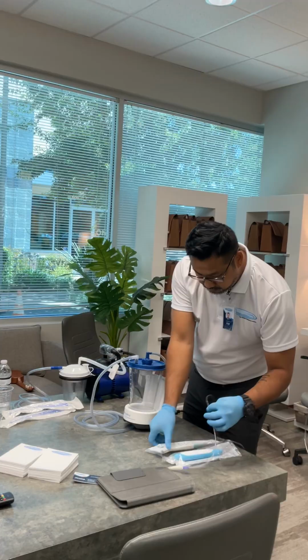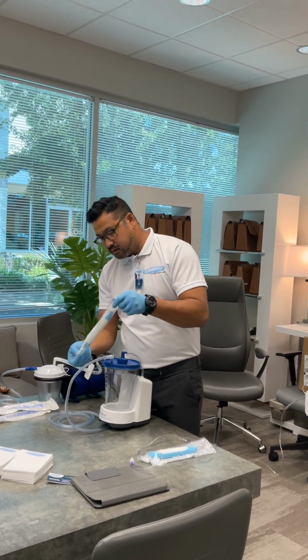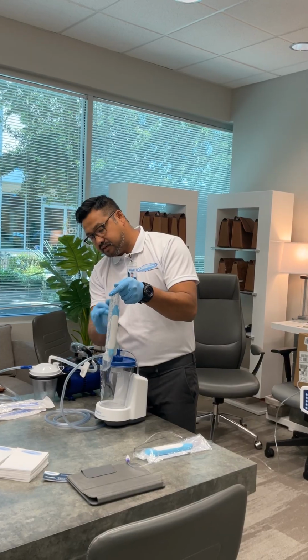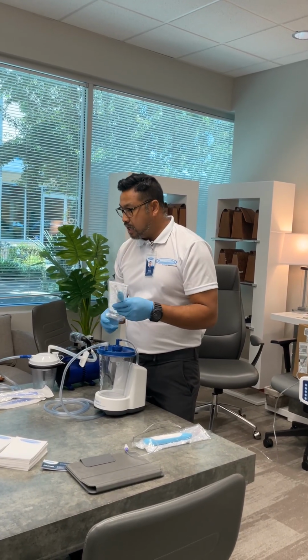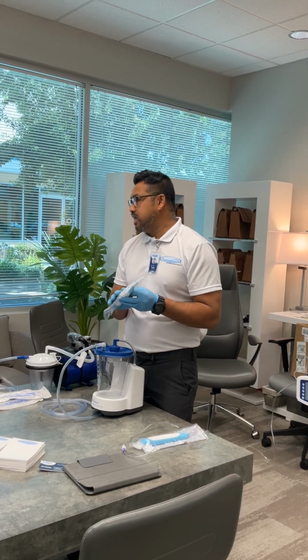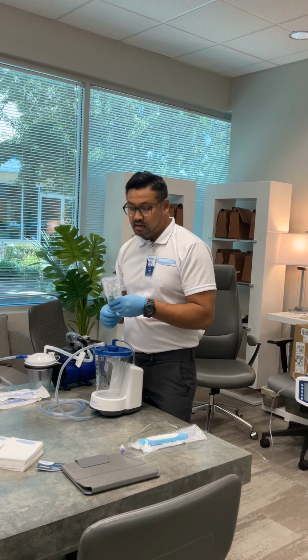I brought the female connection here. This is a sponge catheter. There's a little diagram up front on how it gets placed on the patient. It's also a 12-hour catheter, again to prevent any bacteria growth. It's good to change this every 8 to 12 hours, depending on how much they soil themselves and so on.